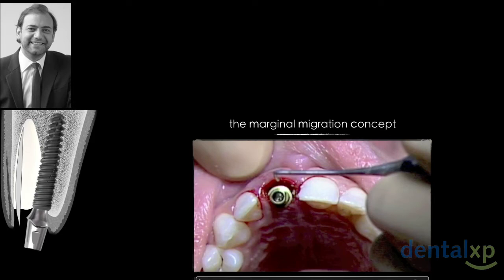Now, not only do we preserve the bone, but with this slowly resorbable membrane we have a barrier in order to keep a tent for our soft tissue, and we also go a bit supracrestal and graft even a bit further coronally.